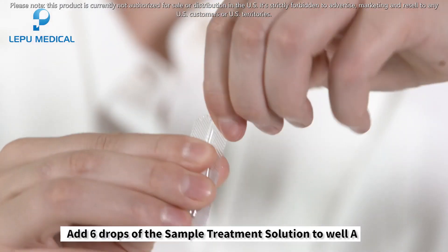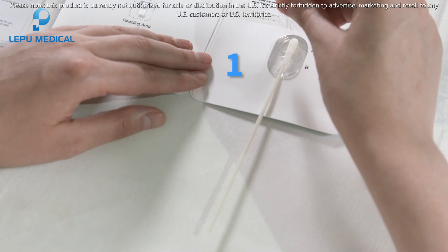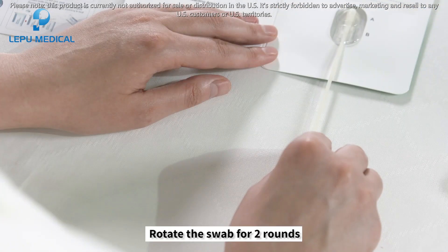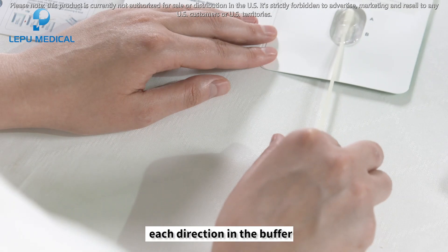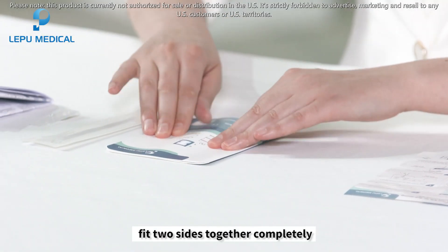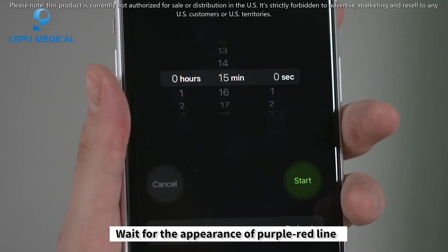Add six drops of the sample treatment solution to well A. Then fold the left side over and fit the two sides together completely. Start timing and wait for the appearance of a purple-red line.